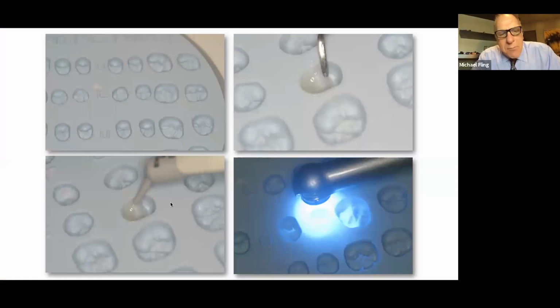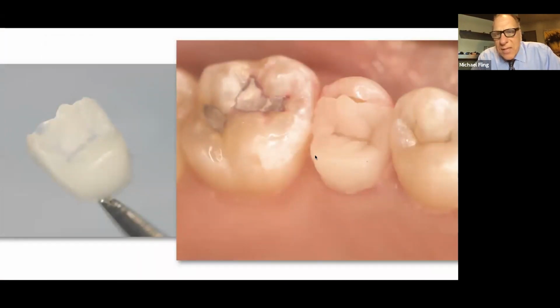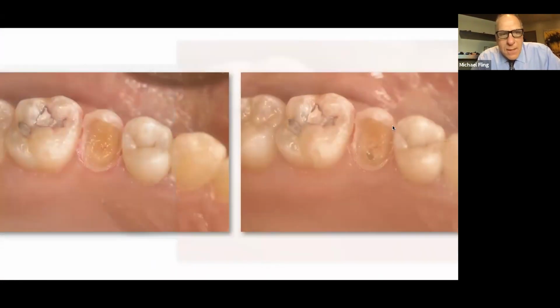Here you see I'm using flowable composite. In this case, I have made a thin shell, a thin onlay out of my Rapid waxer. I trim this until it passively fits on that tooth. I have removed the decay. I have placed a pin to help with retention.